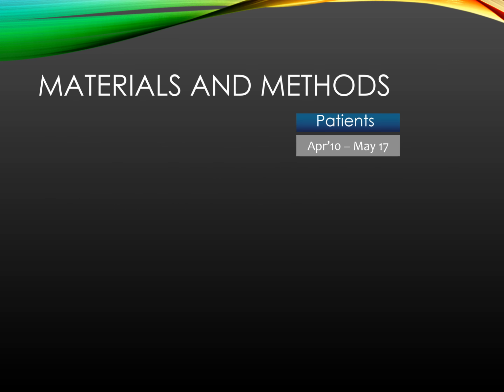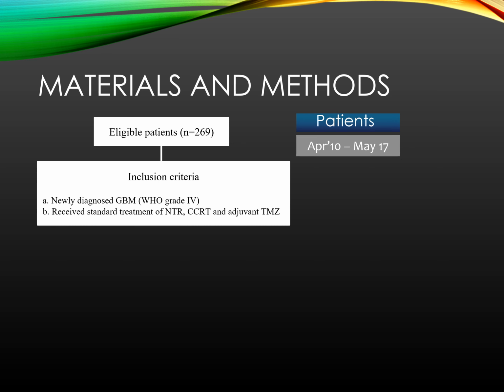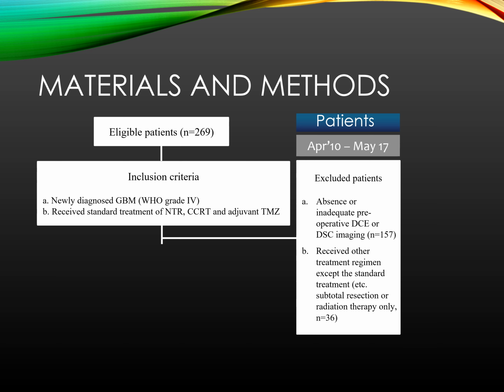From April 2010 through May 2017, a total of 269 patients who were newly confirmed with GBMs were consecutively enrolled in this study. Inclusion criteria were newly diagnosed GBM and receiving preoperative DCE, DSC MRI, and standard treatment. Exclusion criteria were absence or inadequate image of one of DCE or DSC MRI and other treatment regimens except standard treatment.